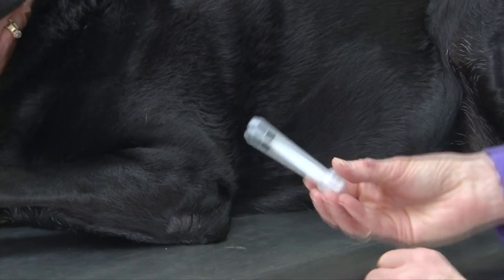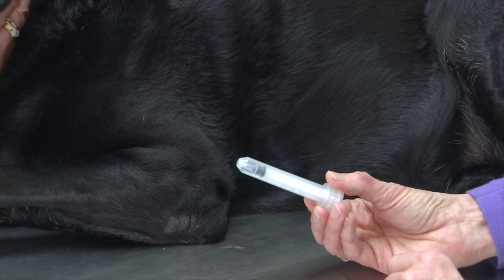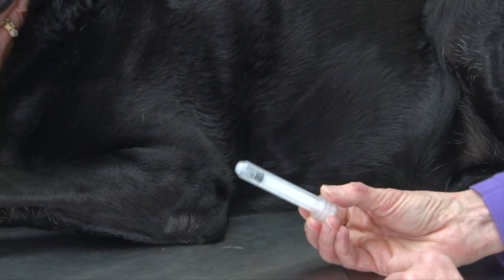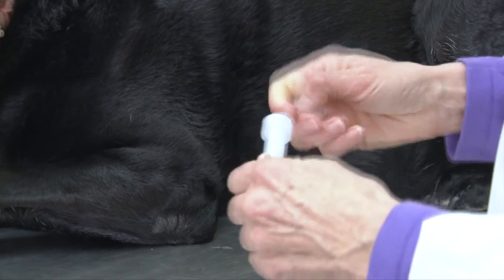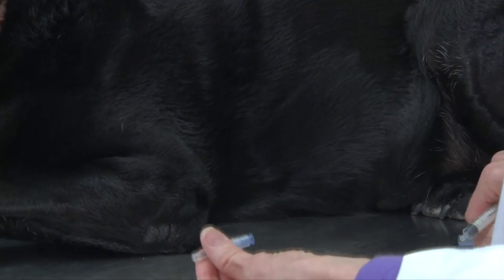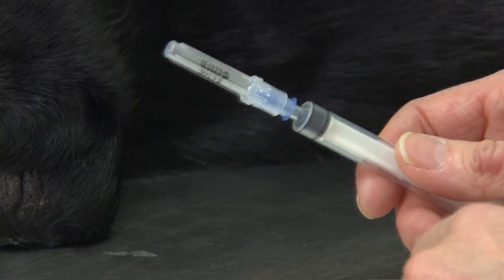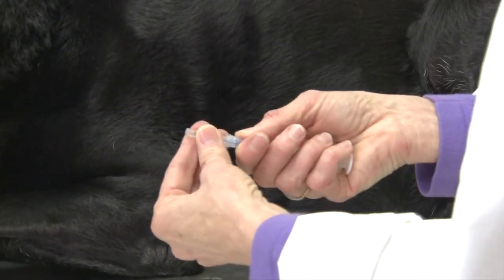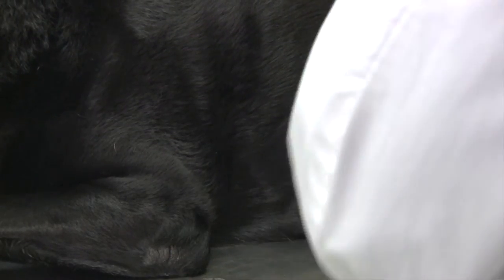The syringe can be 3 ml up to 10 to 12 ml in size. We will prepare to do the aspirate by assembling our syringe and needle, attaching those two together, then take the cap off of the needle so that you're ready to do your aspirate.